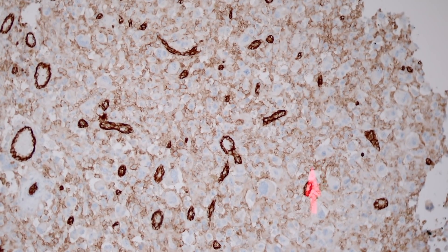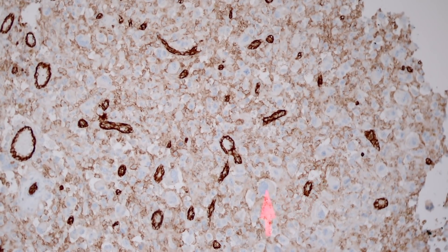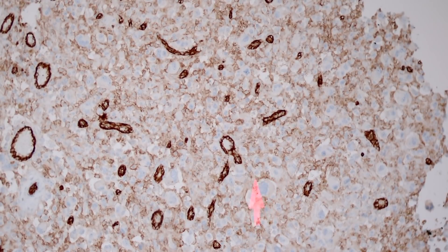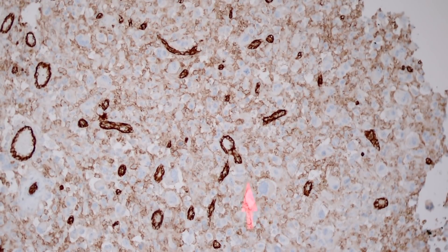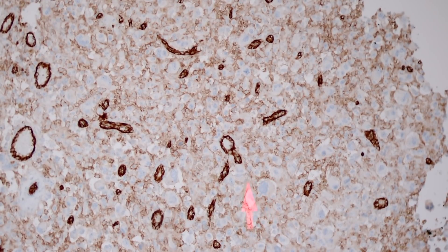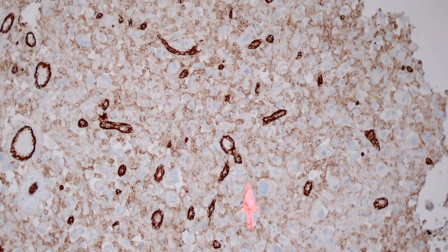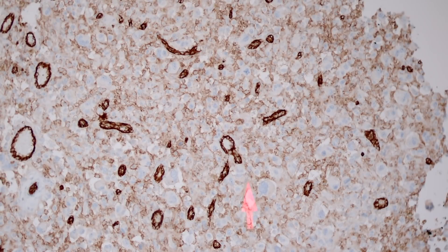These are clearly tumor cells, but a lot of the staining is actually in between those tumor cells — from small histiocytes filling in the spaces, because again this tumor had a lot of hemorrhage in it.